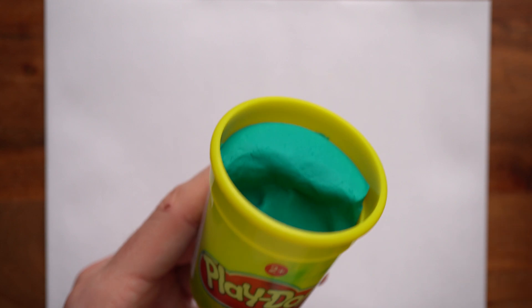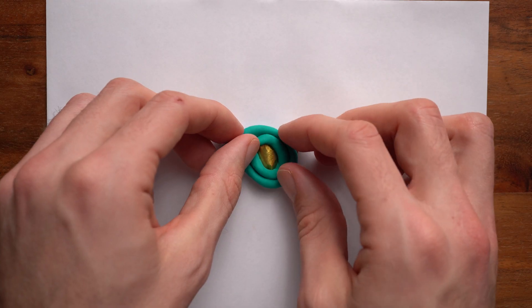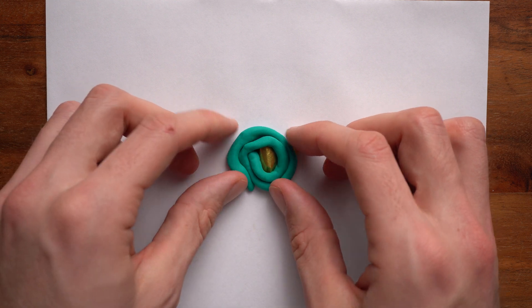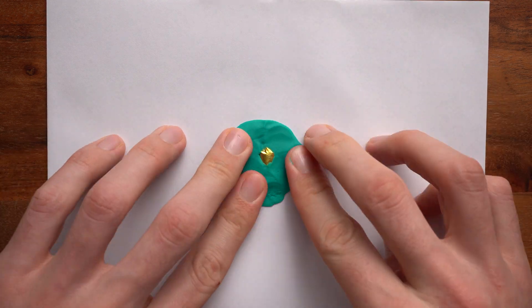Step five: take your second color of Play-Doh and use your fingers to roll it into a worm. This will be your iris, so it's cool to have a color like blue, brown, or green. Step six: roll up the Play-Doh and put it on top of the tinfoil. This will create an iris and also keep the tinfoil from moving.